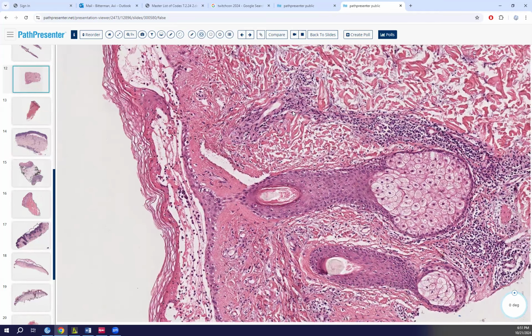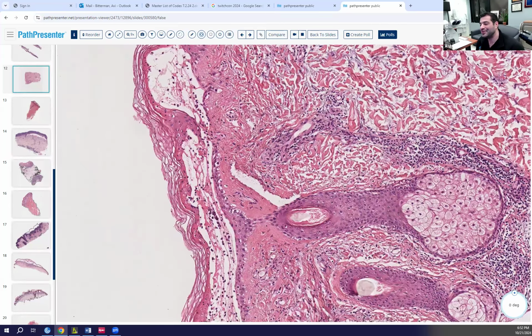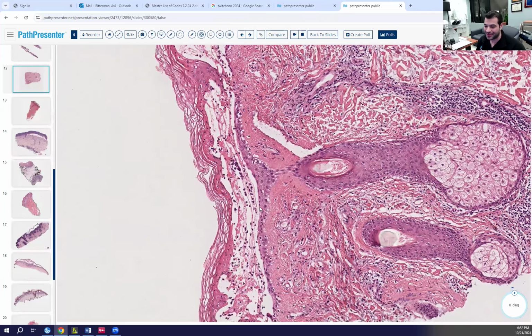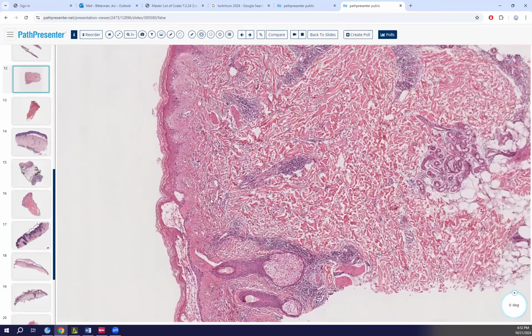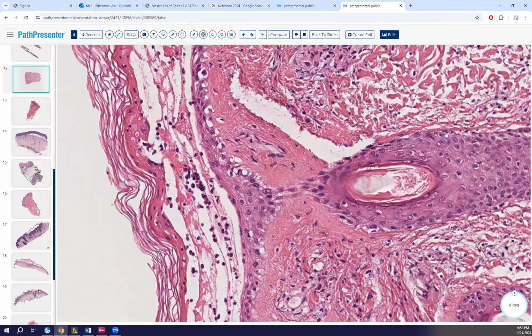Reepithelialization. And where does reepithelialization happen from? From the hair follicles, because there are all the stem cells in the hair follicle. Yes. So you can get reepithelialization, which could confuse you. It could be tricky, so you go by the deepest one. Also, reepithelialization usually gives you a squamatized basal layer. The cells aren't as basaloid, so that can be a clue to help you out.